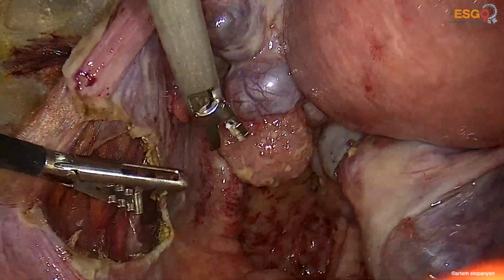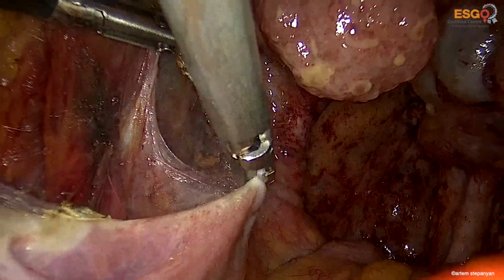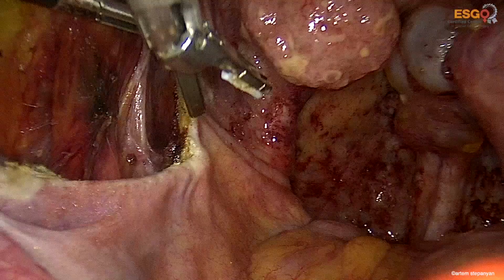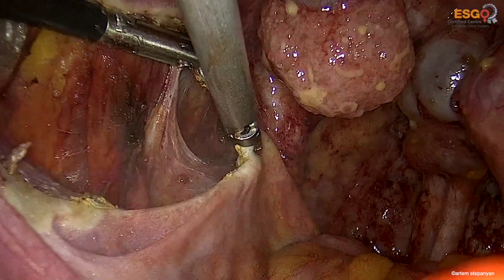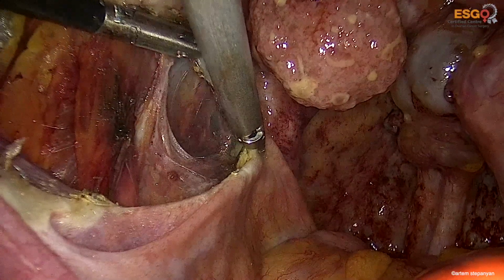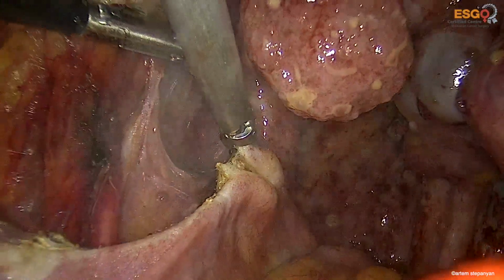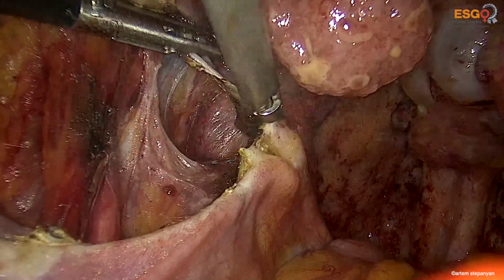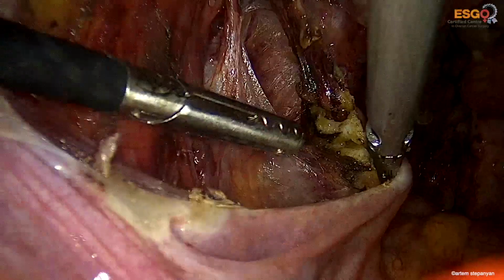The incision is carried out across the mesorectal fat and mesorectal fascia, downwards toward the uterosacral ligament.